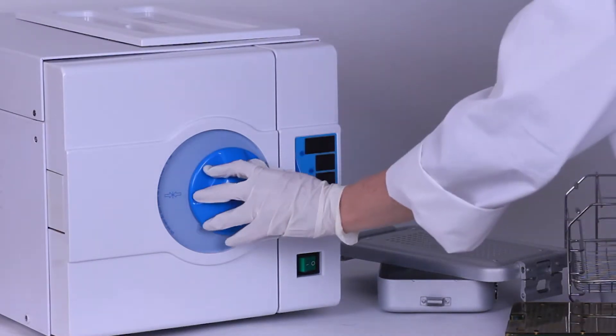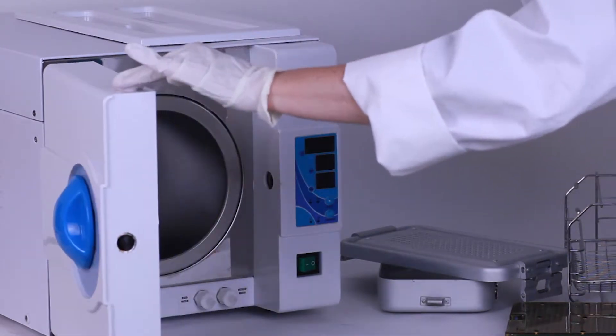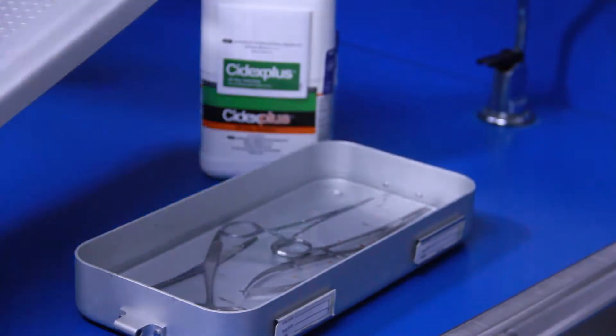Autoclaving, which is a saturated steam under high pressure, is the most common method for sterilizing surgical instruments, but a cold sterilization method may also be used.